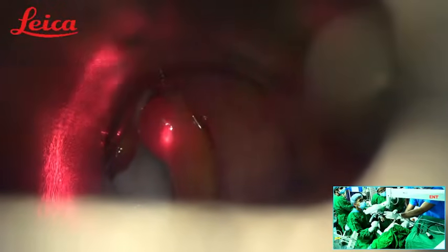What is the beam size? Ultra mode dot. It could be incision line. Focus here. So here focusing with the micro manipulator, there are fine adjustments in the micro manipulator.